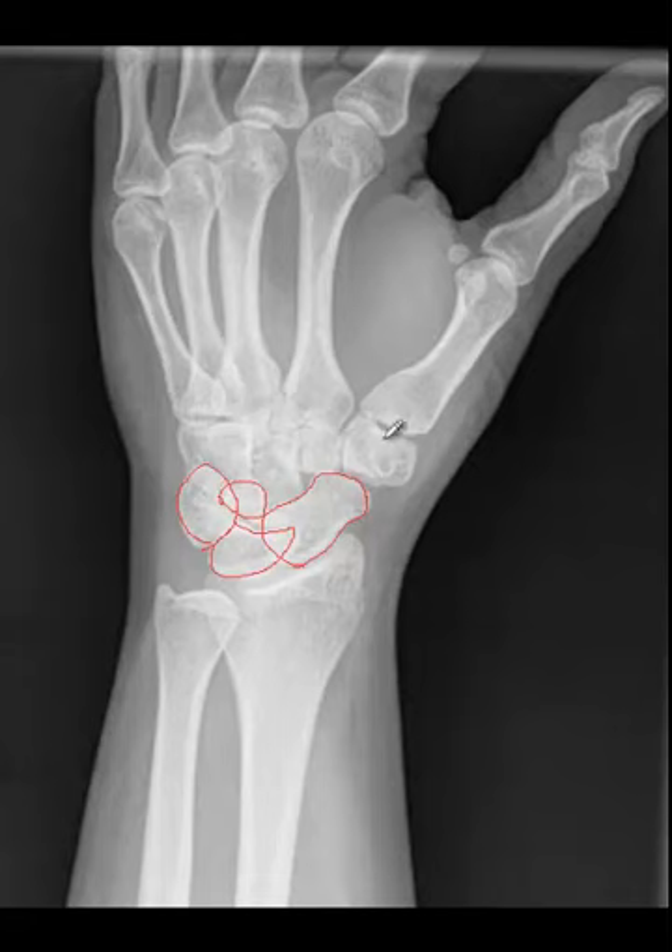Coming to the distal row, under the thumb is going to be the trapezium. Medial to the trapezium is going to be the trapezoid, which is trapped between the trapezium and the capitate, and of course the hamate. We don't see the hamate hook very well, so this is going to be the most difficult portion.